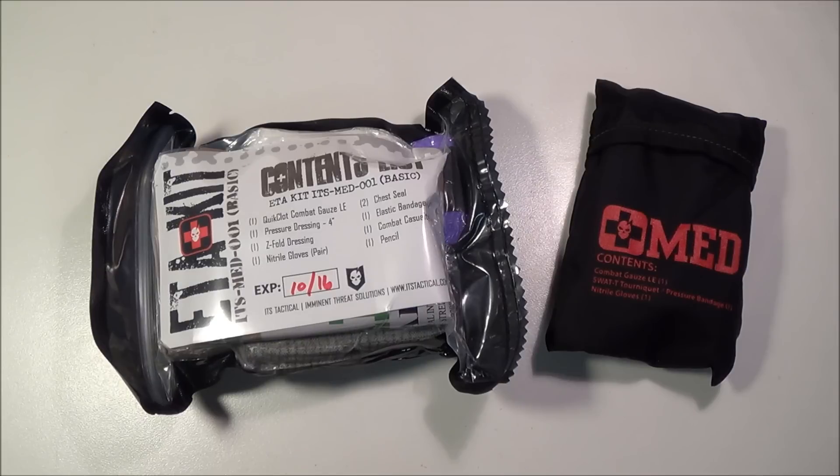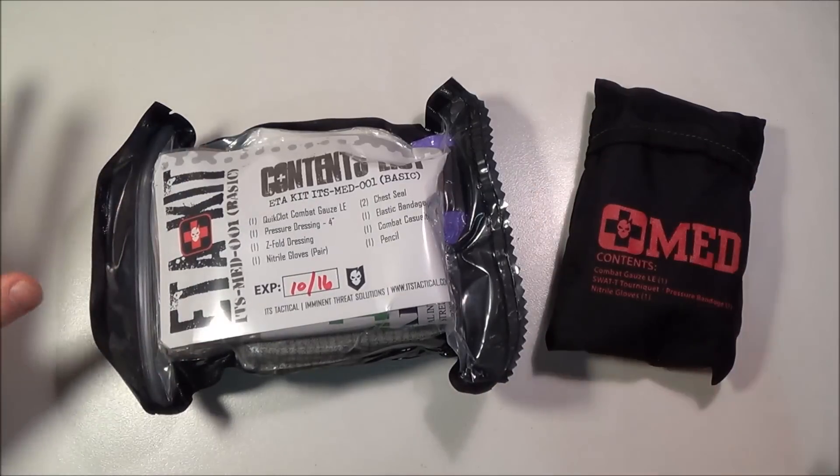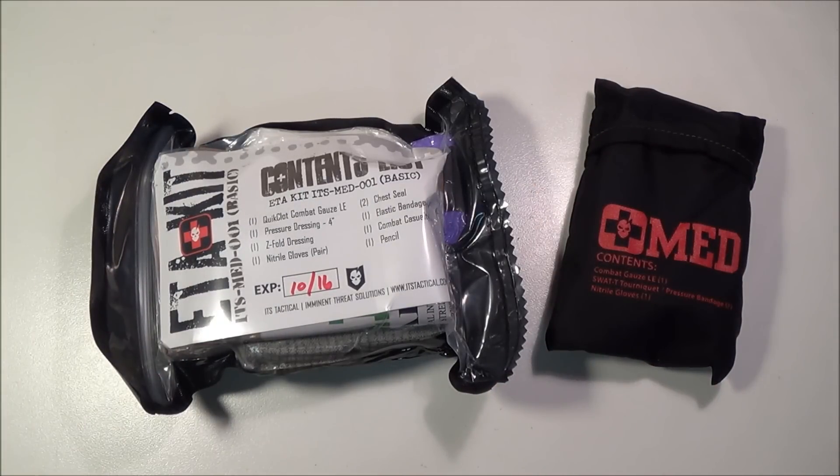I really do want to make a video showing you guys step by step what I think you should put in an EDC trauma kit that you can carry on you, or with your EDC gear, in your range bag, hunting bag, whatever. I'd like to show you the step-by-step components and a price breakdown of where you can buy them. But as an already-made kit, these are two of the best I've seen on the market.